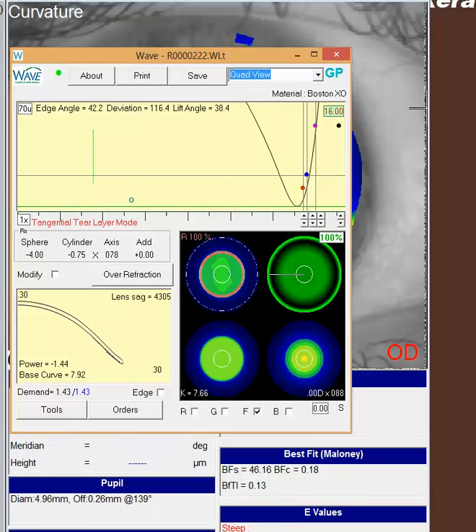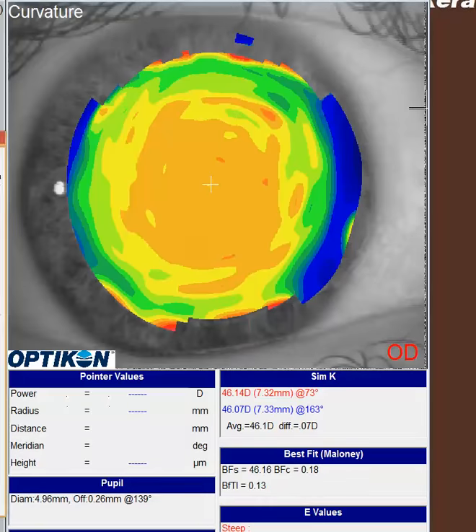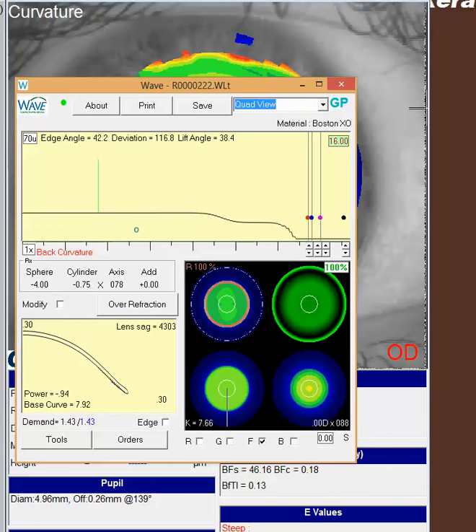Just to summarize, the easiest thing to do is take your lens and just increase that back OZ a little bit, and I think that'll get you a little bit more workable room before you get this little change in the back surface. I would try that first, and hopefully that'll get you where you need to be.